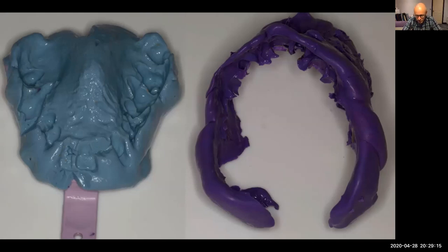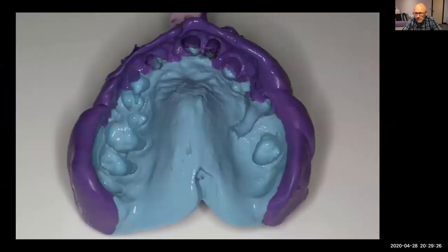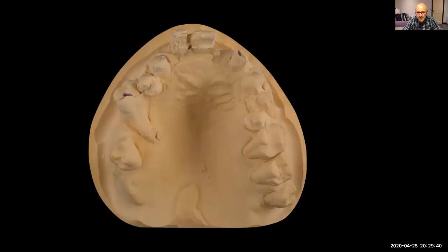And then what Rowan does when he gets it through in the lab, he dries the alginate and then sticks them together with super glue. He uses super glue all the time in the lab. It's fantastic. But look at it. Isn't that a great impression? It's recorded everything we need to produce a superb immediate denture.